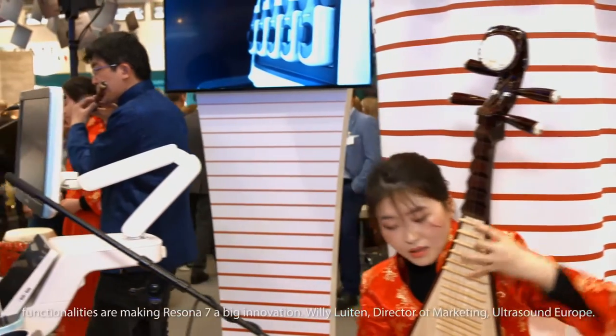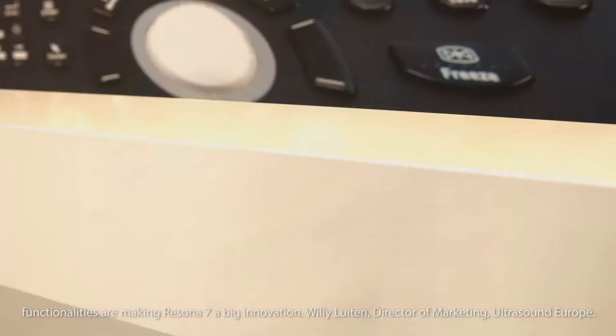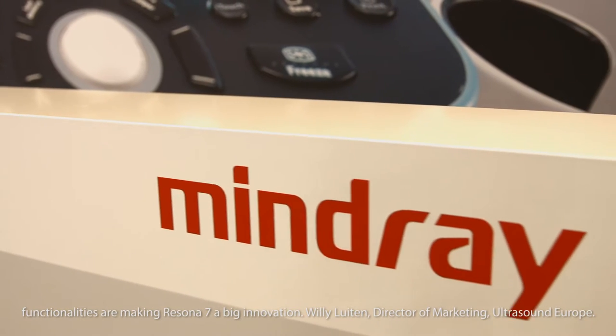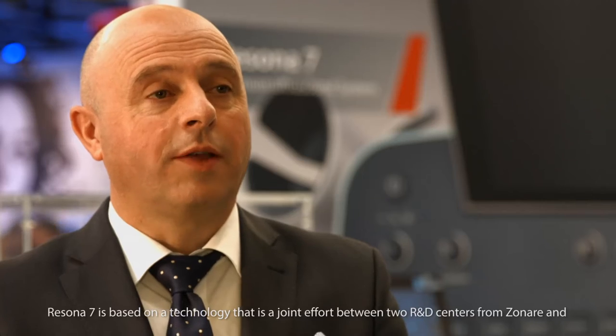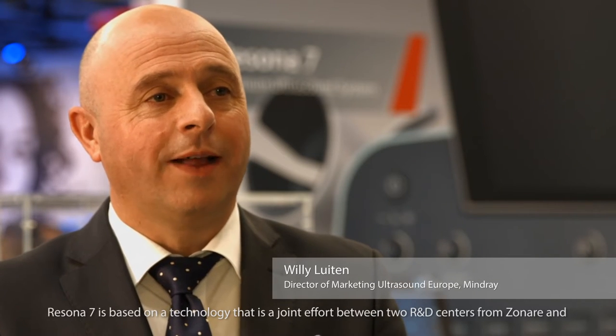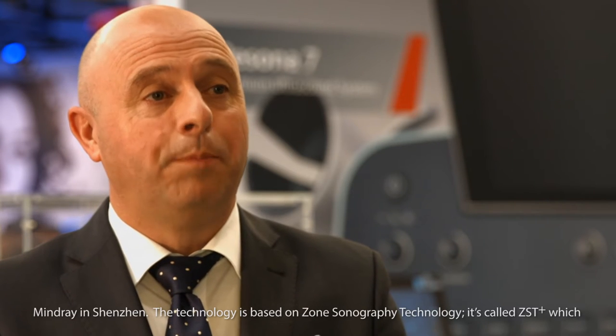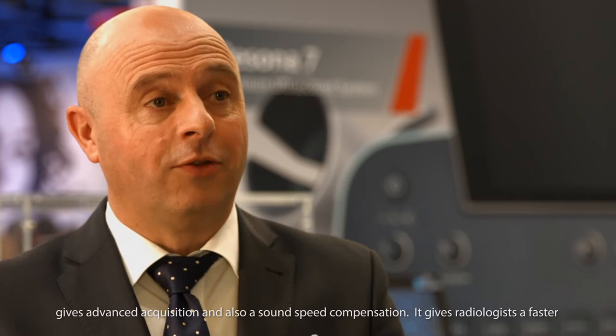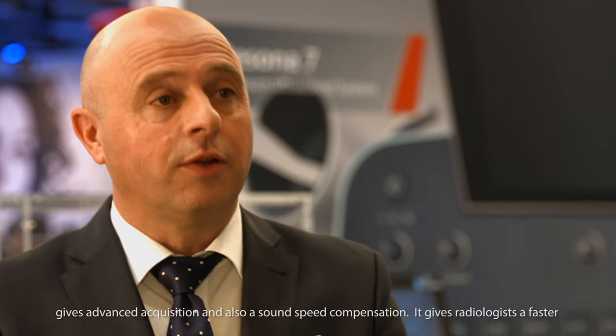But these functionalities are not the only thing making Resona 7 a big innovation. Willie Luiten, Director of Marketing, Ultrasound Europe, explains: Resona 7 is based on a technology that is a joint effort between two R&D centers from Zonare and Mindray in Shenzhen. The technology is called ZST Plus — Zone Sonography Technology — which provides advanced acquisition and sound speed compensation, giving radiologists faster diagnostics and higher accuracy.